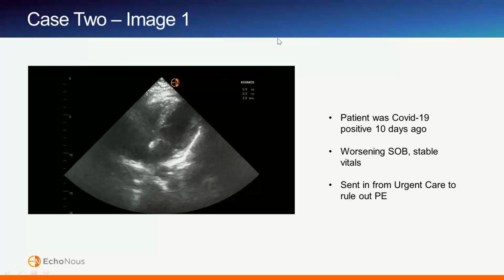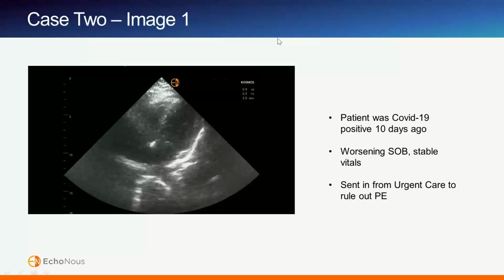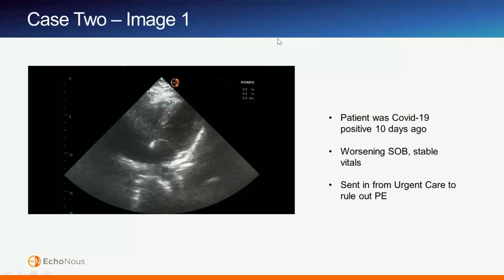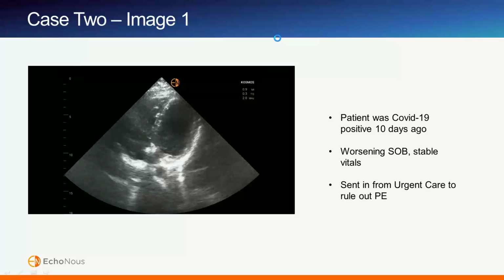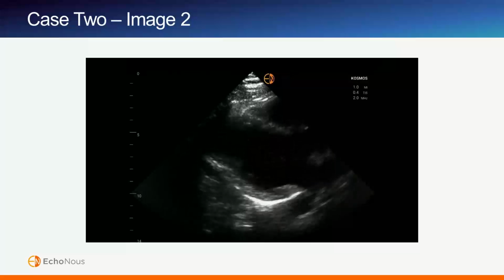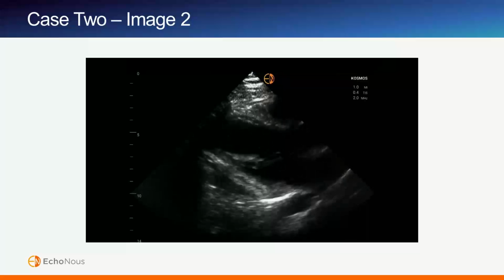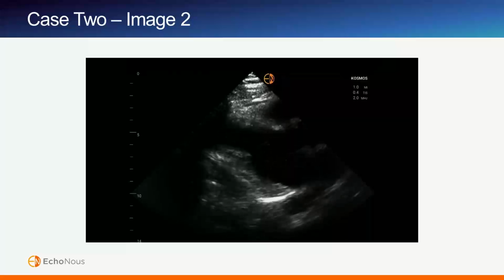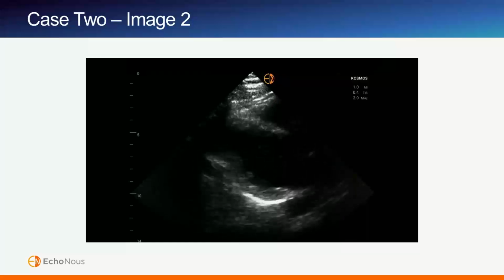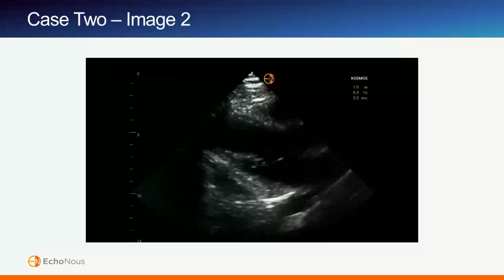Absolutely. Was that your thinking? Yeah, absolutely. So I think the first thing is, I totally agree with you. The RV isn't so evident in this view. And so I always tell my residents and my learners, if you feel that you can't see something in one view, try and see things in a different view. So I'm going to move quickly to a parasternal long view, which is less so for RV versus LV comparison. We're here looking more at LV function, seeing the contractility of the left ventricle. And I don't know if it portrays well on the GoToWebinar, but when I look at this, I didn't see a pericardial effusion, and just the same way as on the apical 4-chamber view, the LV contractility looks pretty good.